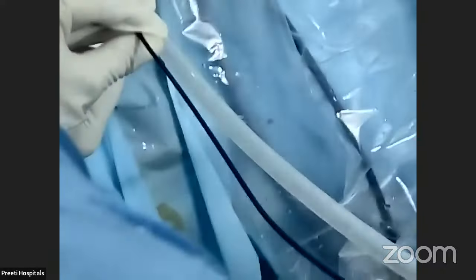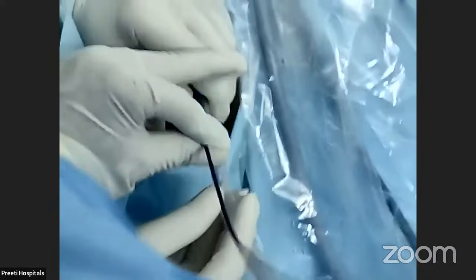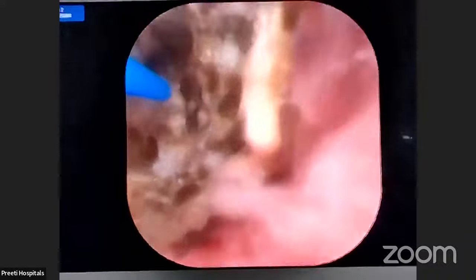Otherwise, the flexible scope will flex the sheath. So you should not be over enthusiastic. After doing this for 17 years, I am still doing it. Don't consider this procedure something you can go and do tomorrow. It is only advances we have to learn. First, do it normally.